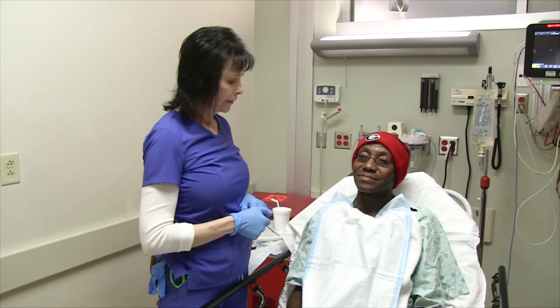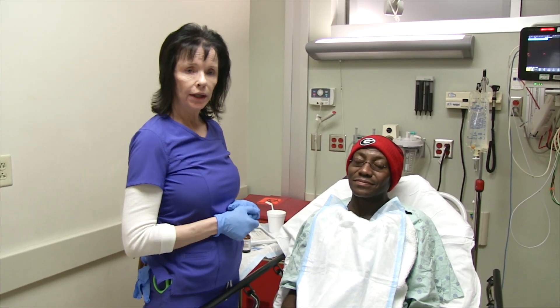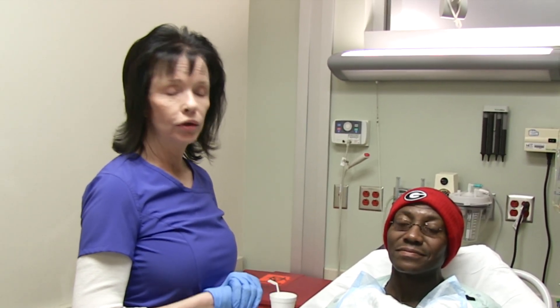My name is Lady Coker. I'm a registered nurse at Augusta University Medical Center in Augusta, Georgia. I'll be demonstrating how to insert a nasogastric tube today.